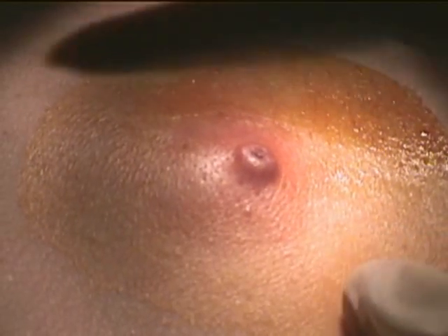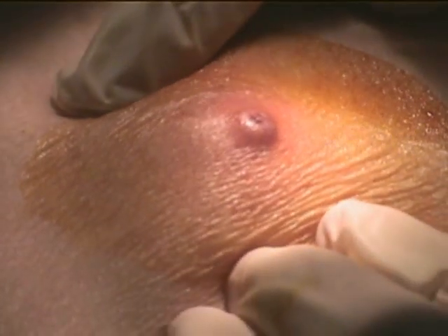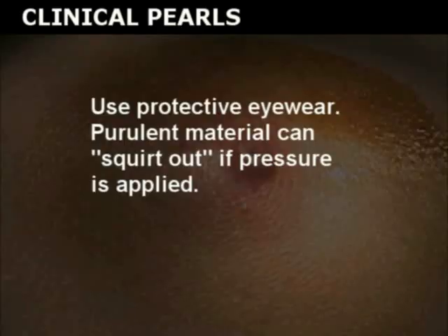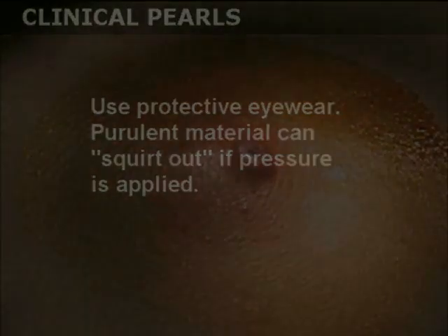Prep the abscess area with povidone-iodine or alcohol. Carefully palpate the abscess to accurately determine the size and location. Use protective eyewear, as purulent material can squirt out if pressure is applied.